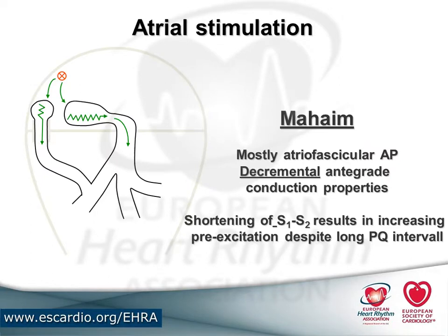So that's a very nice way. Again, if you have seen that and you can induce the tachycardia reproducibly, then you need to look out for that, and they're usually posteroseptal. You need to look very, very carefully in that area, mostly in young adolescents or young children.